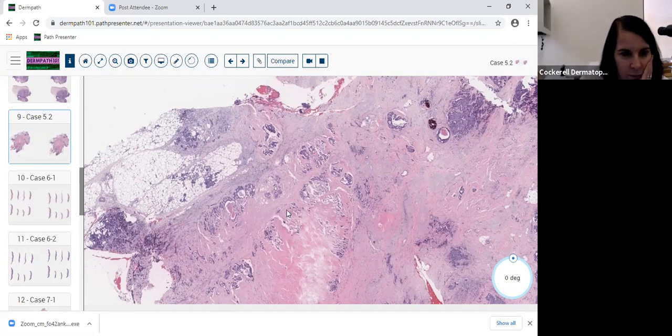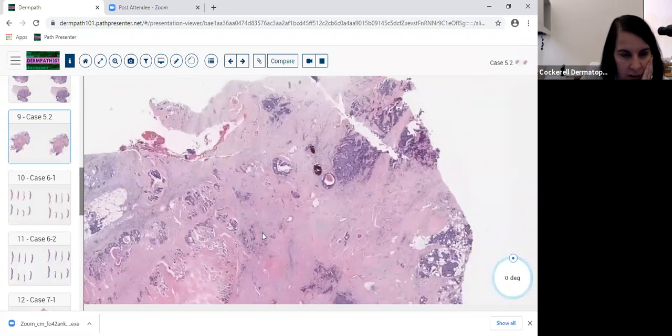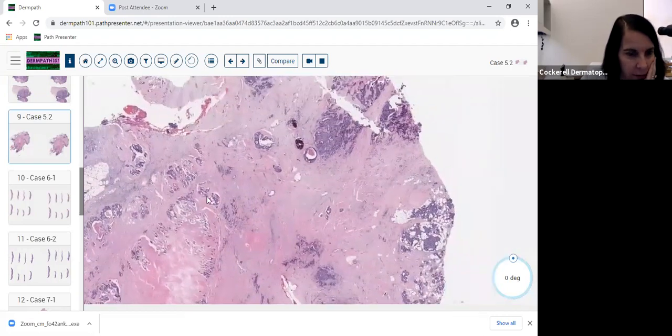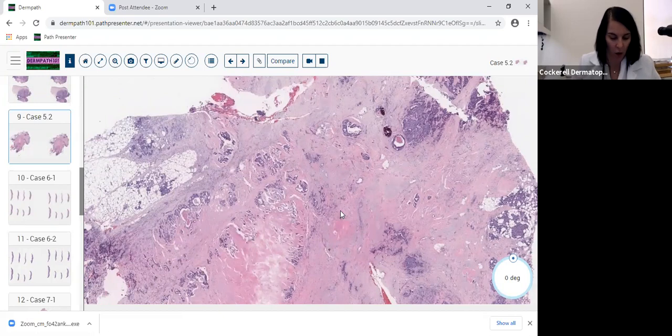cancer. We can also do the PR. And for the oncologist, they'll definitely want the HER2 neu stain. So we do those three because when it goes to the oncologist, it'll affect what treatment they'll be giving the patient. So this was a metastatic breast adenocarcinoma.